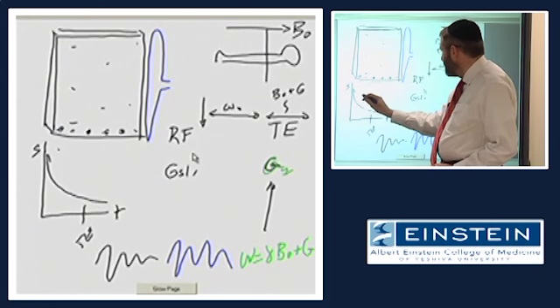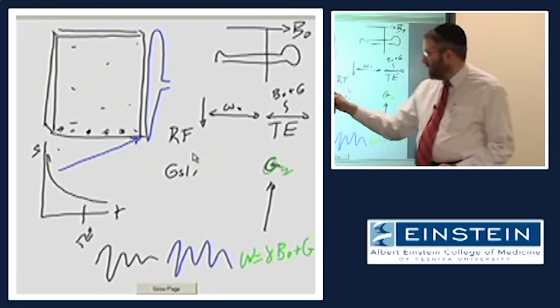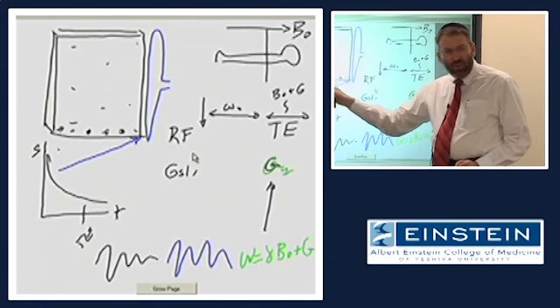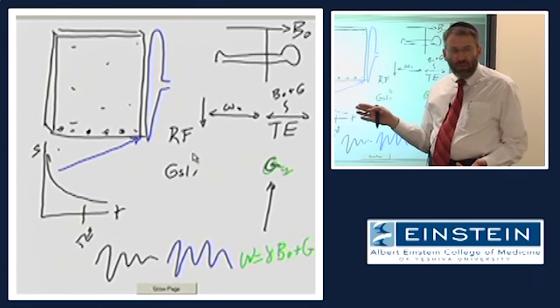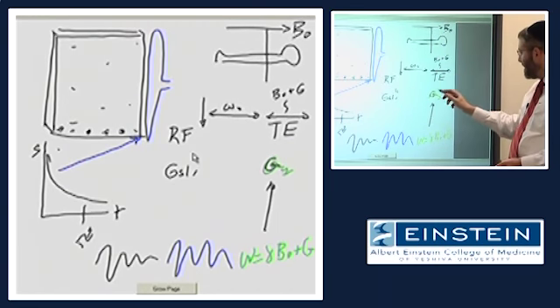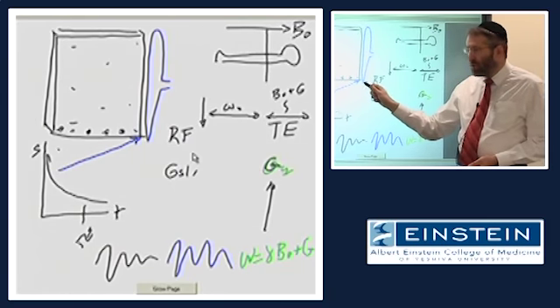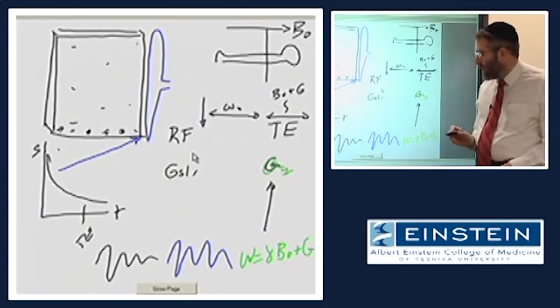If this makes it any better, it is a gradient magnetic field, meaning that the strength of the gradient is changing from left to right in the image. As a result, the net field strength experienced by these spins, depending on where they are along this left-right dimension, varies. Right? And since their field strength varies, their frequency of precession varies, which means that the signal we sample is composed of a whole bunch of components, each at a different frequency, depending on the location left to right.